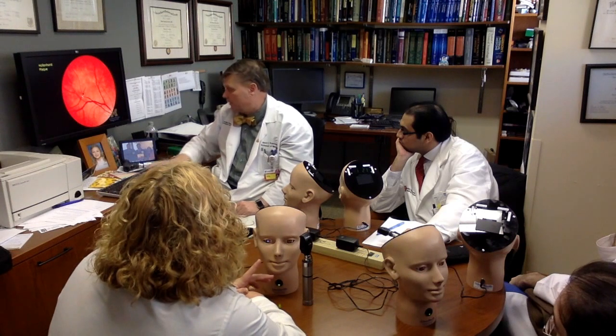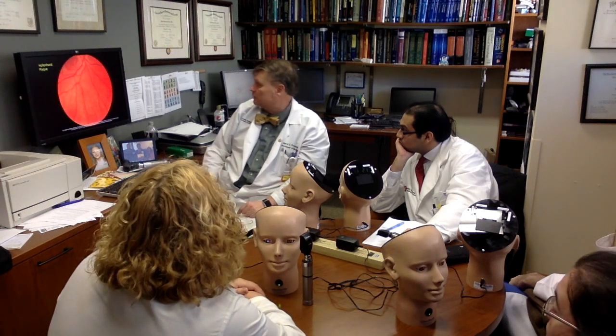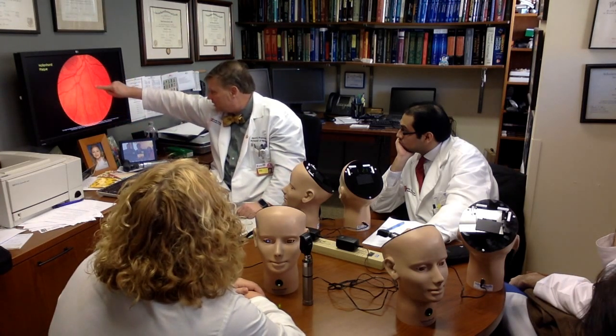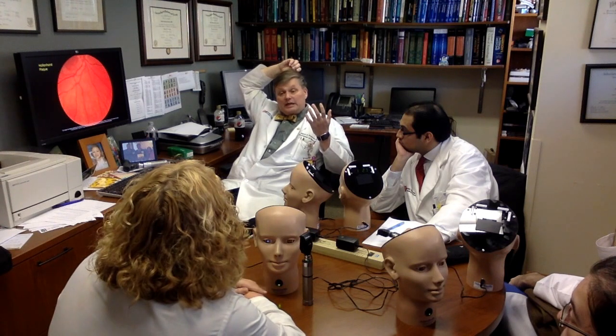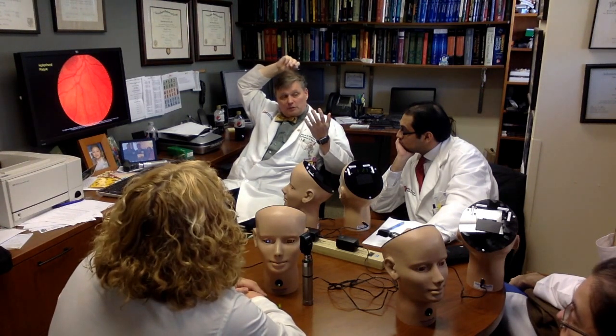Here's another Hollenhorst plaque. You say, oh, it looks pretty good, looks pretty good. Oh, there's this one bright yellow spot. And you look closely, and here's this little artery, and it's bifurcating right there, and it's stuck right there. So that could be the key to your case for the person who had the funny spell.